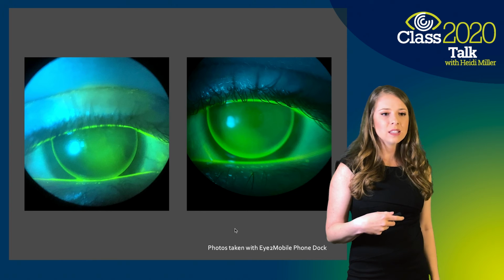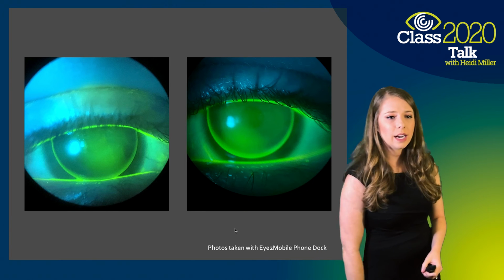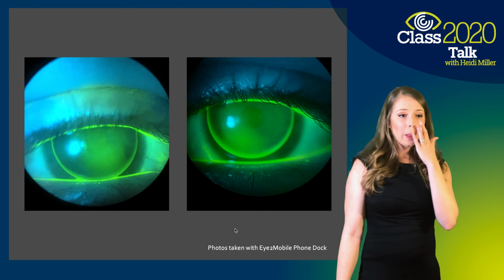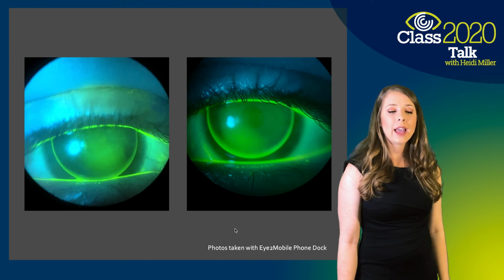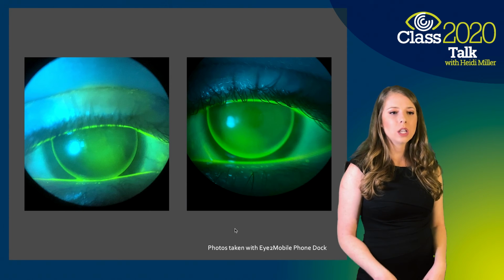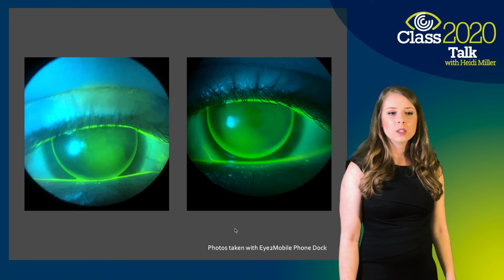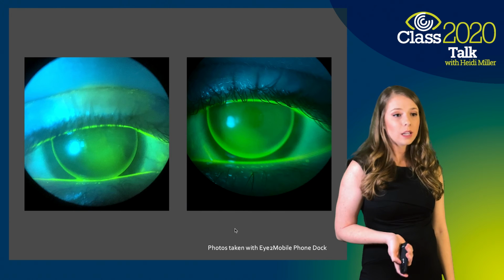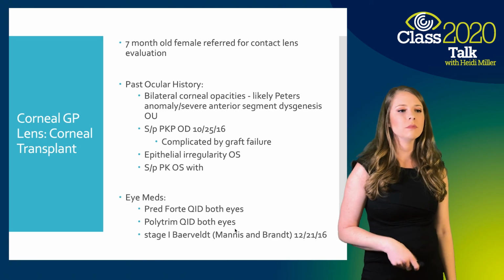And this is what these lenses looked like on her eyes. They were fitting well, a little bit lid attached, good edge clearance there. And I took these pictures just using my iPhone dock on the slit lamp so I wouldn't have to move her in and out of the room, and thought those looked great and they're fitting well and she's comfortable.